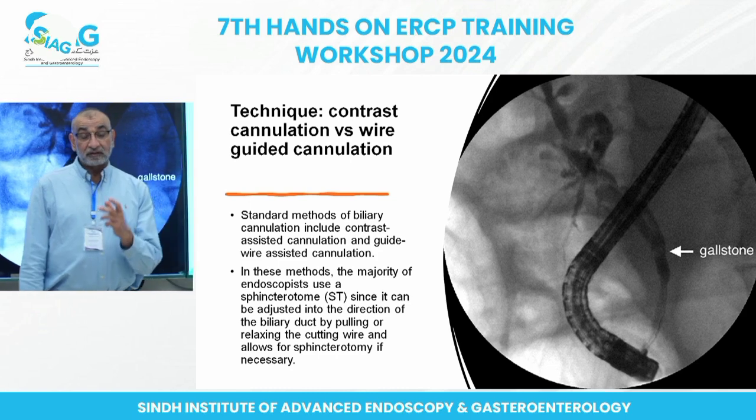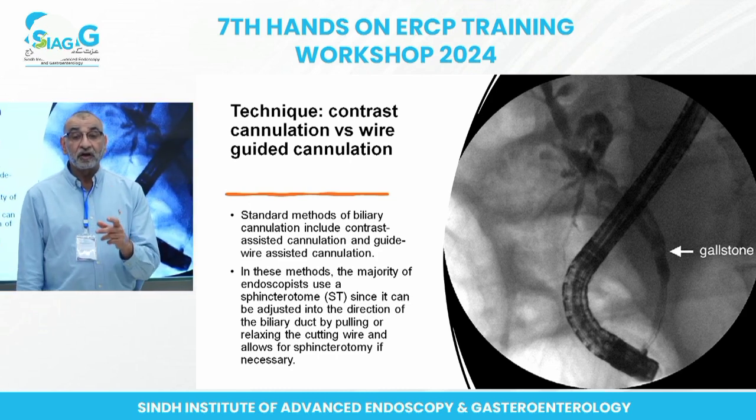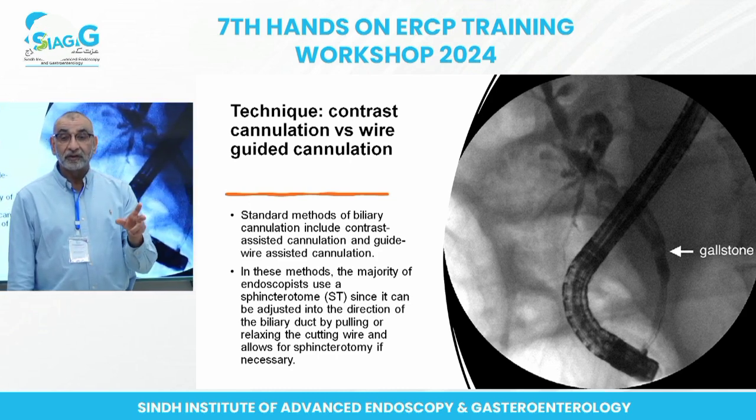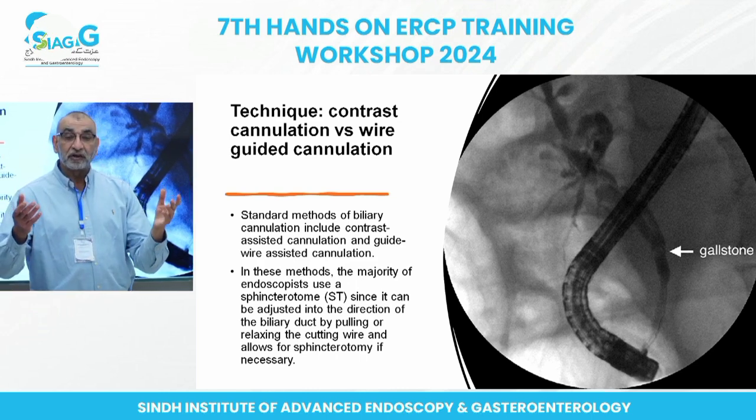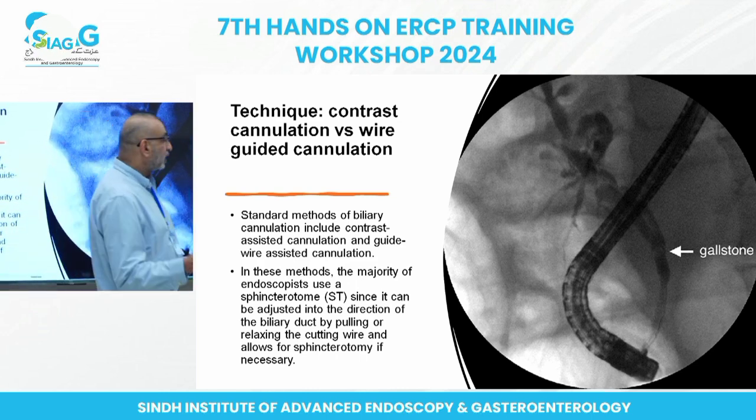As I said earlier, you only inject contrast when you've got fluoroscopy on. Don't inject contrast before, because you don't know where it all ends up. So always inject small quantities.